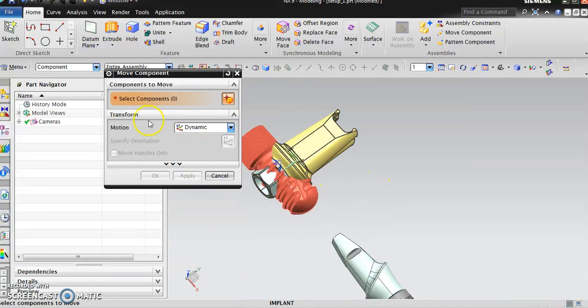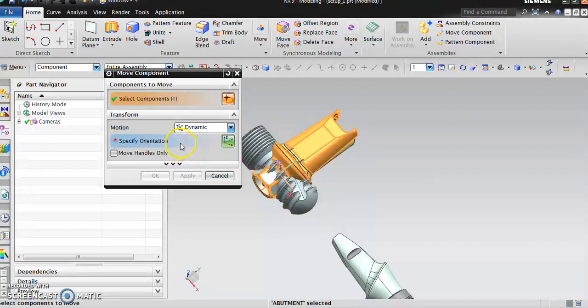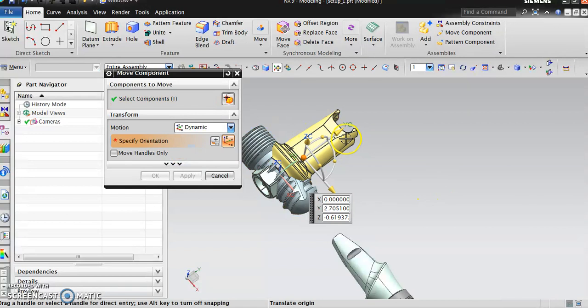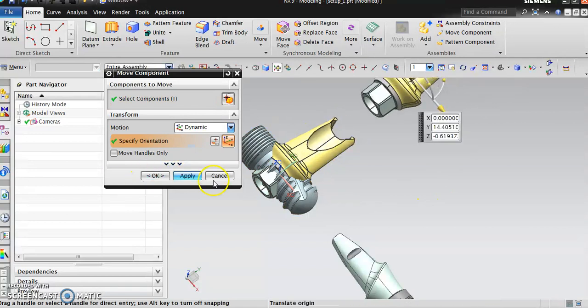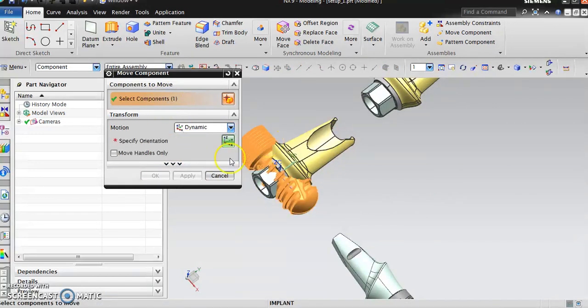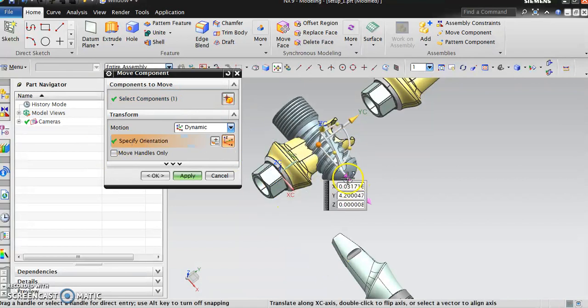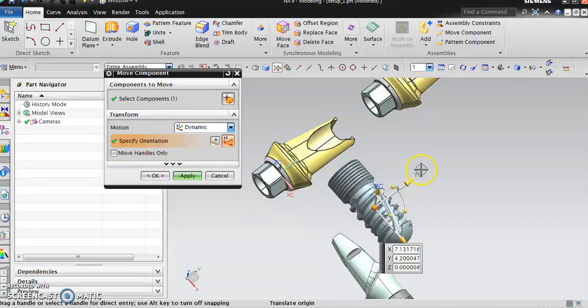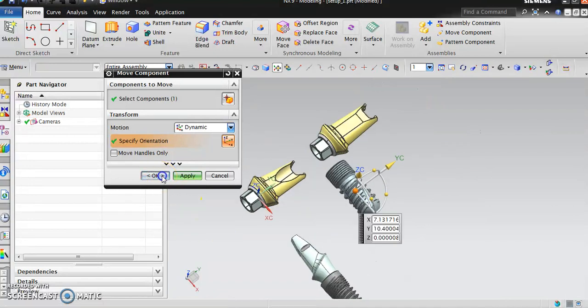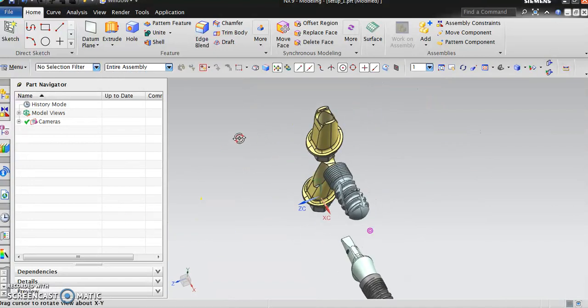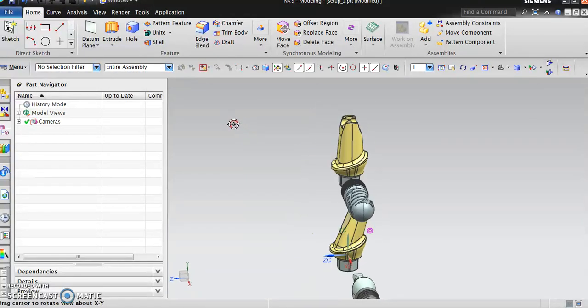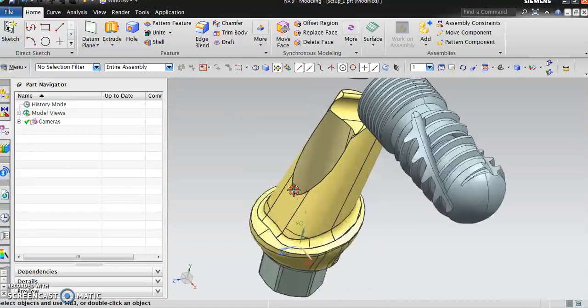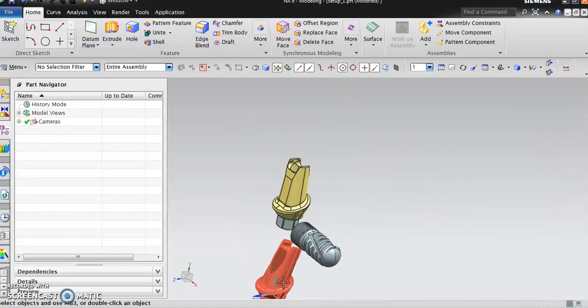Let's select the abutment on the top and pull it. Go back and select this one, bring it down. As you can see, there are two different abutments: one is straight, the other is at an angle.